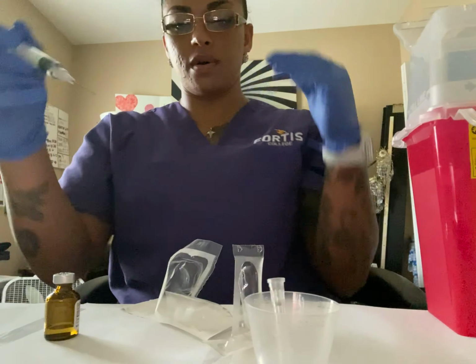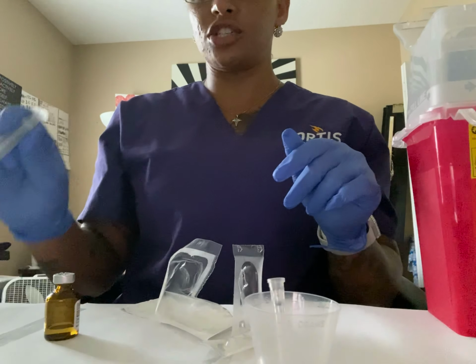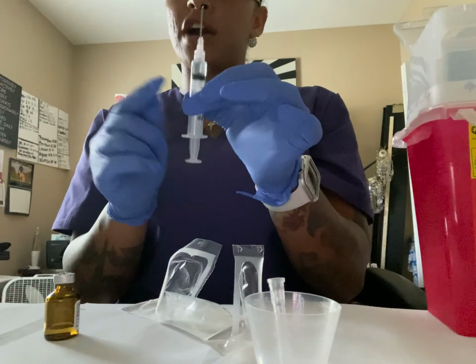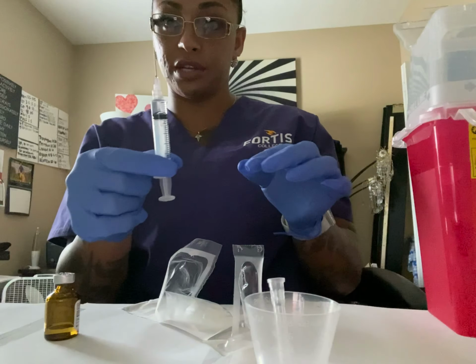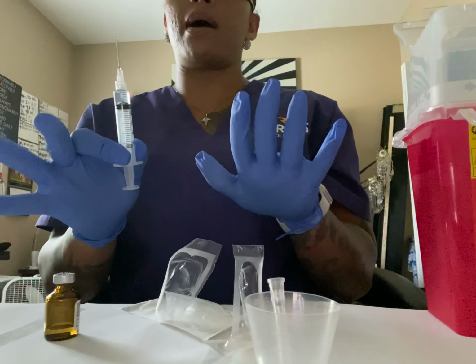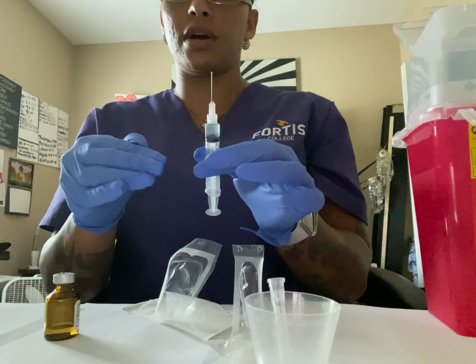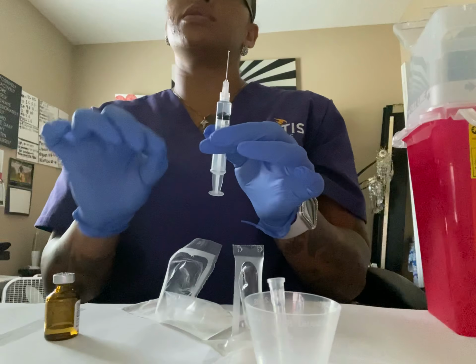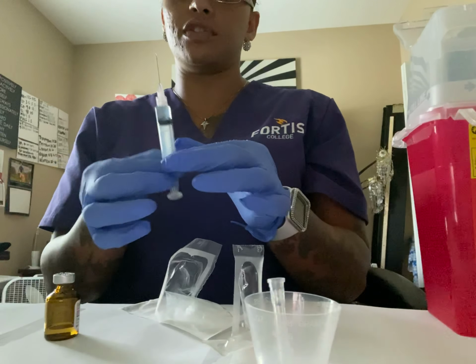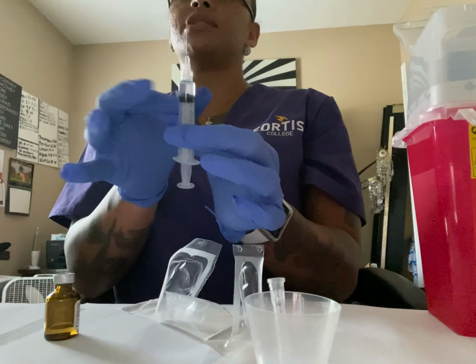Pull that out. And we are going to administer the medication to the patient, and we're going to verify that we do have 1.5 milliliters of medication in here, that the ordered amount was measured at eye level, and that it is correctly drawn up in the correct dose in the syringe. You're going to check for bubbles. If there are any air bubbles, you want to tap and make sure we get the air bubbles out.